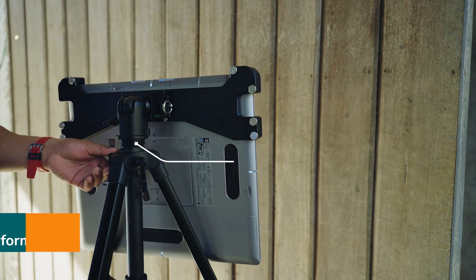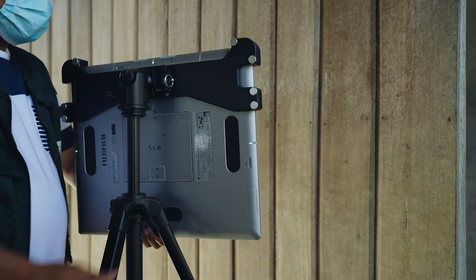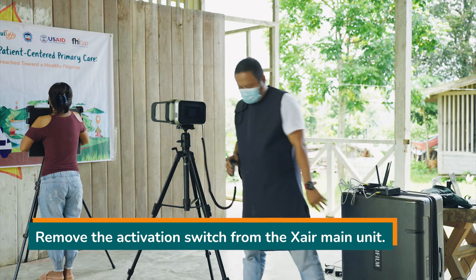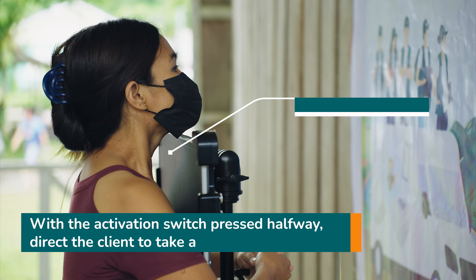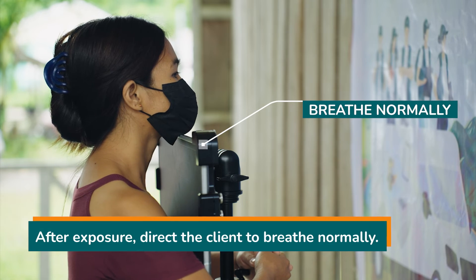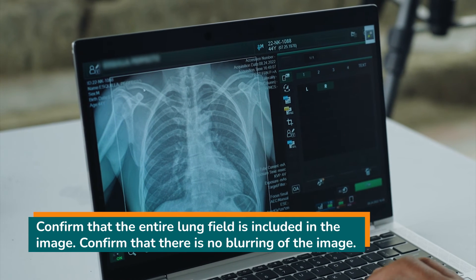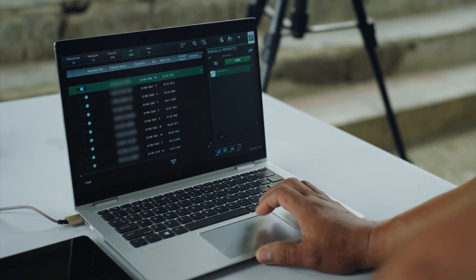Turn on the X-ray and turn on the LED collimator. Use the collimator tab to adjust the radiation field size to the panel. Check the position of X-ray incidence and perform vertical adjustment if necessary to adjust the height of the panel and the X-ray. Check the FPD on the console and make sure the green lamp is lit to signify that it is ready. Remove the activation switch from the X-ray main unit. With the activation switch pressed halfway, direct the client to take a deep breath and hold it. Press the activation switch fully to make an exposure. After exposure, direct the client to breathe normally. Return the activation switch to the X-ray main unit.